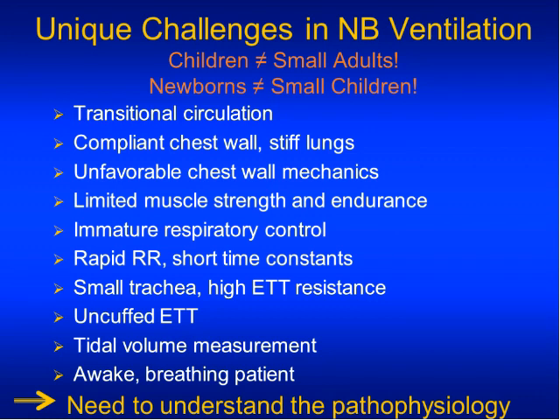We use uncuffed endotracheal tubes, which means there's almost always a leak, which importantly affects how we can measure tidal volume. And that's an important aspect we'll talk about in some detail later on. And to make things more exciting for ourselves, we allow our babies to be awake and breathe, as opposed to the heavy sedation more commonly employed in adult and pediatric ICUs.